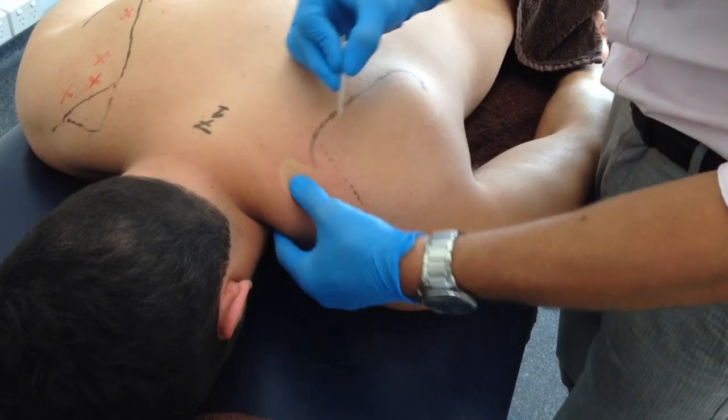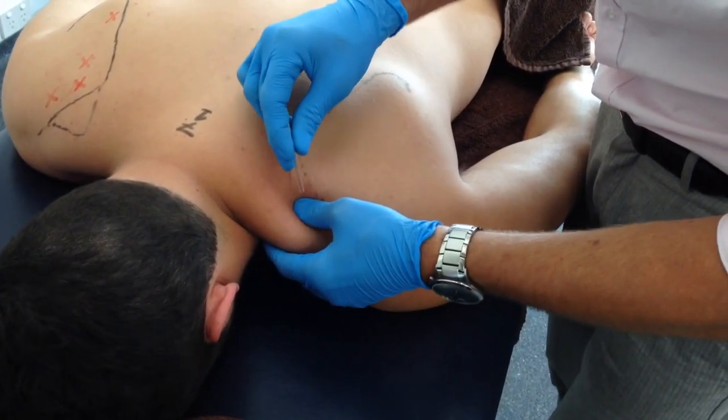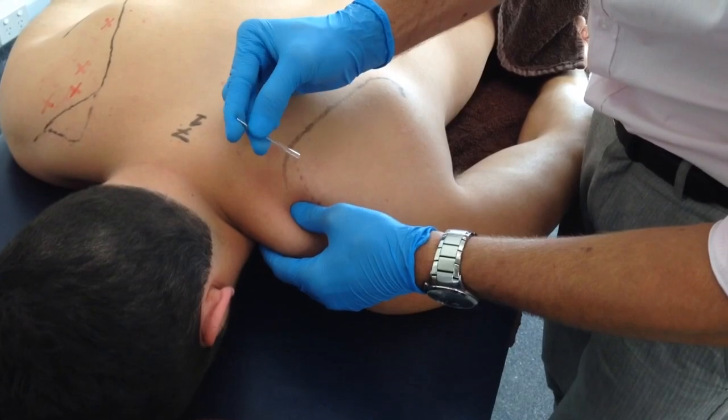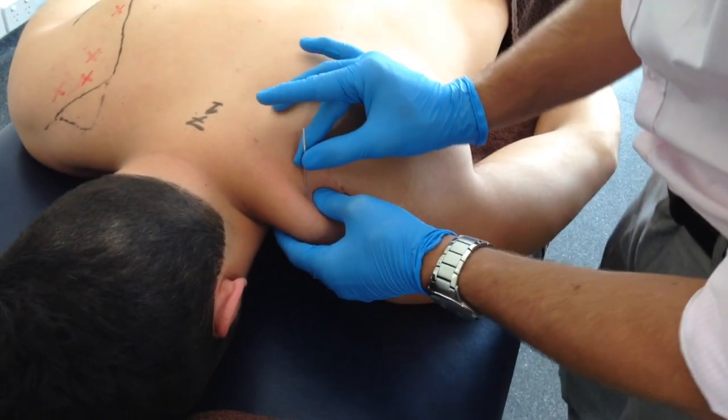The anterior and more medial trigger points should be needled in a posterior to anterior direction. The more lateral trigger point should be needled in a posterior to anterior and cephalad direction.